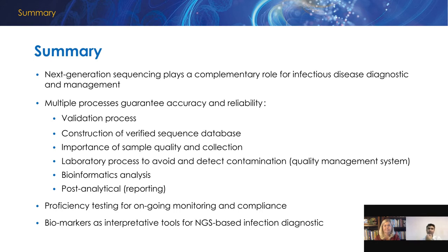If you are processing a specimen looking for bacteria and fungi, ideally a quality control material should include some of the bacteria, but you can also include some of the mold, especially during the extraction protocol, because we know that they have different cell walls, they have a different structure, and some of the extraction protocols need to continue being overseen and evaluated during the whole analytical process of the sequencing.